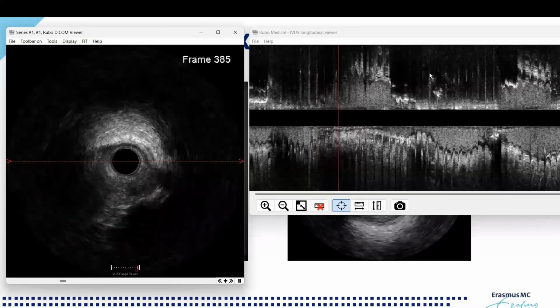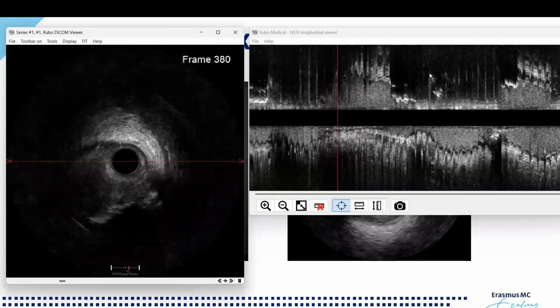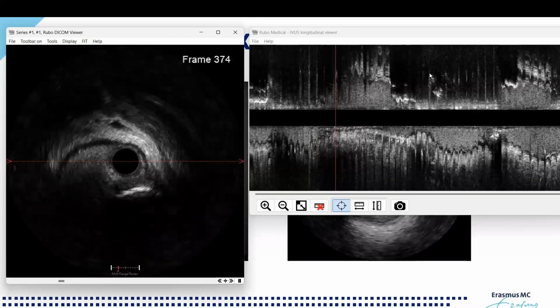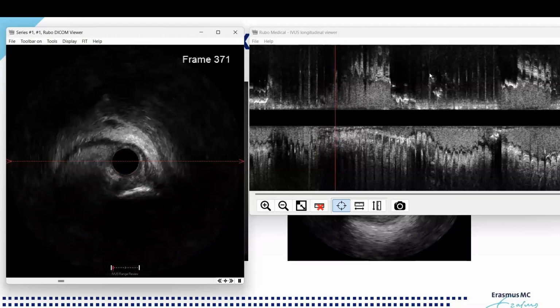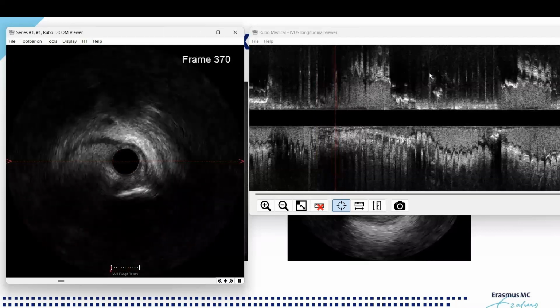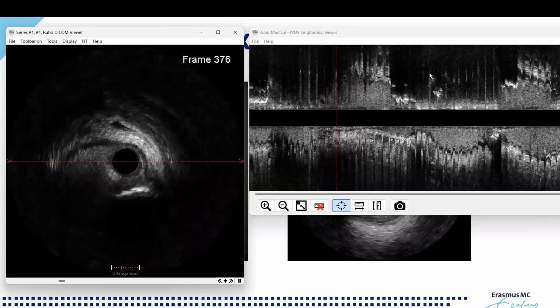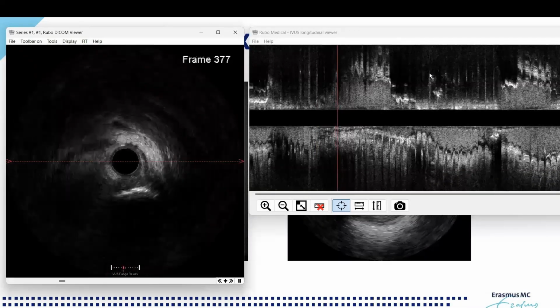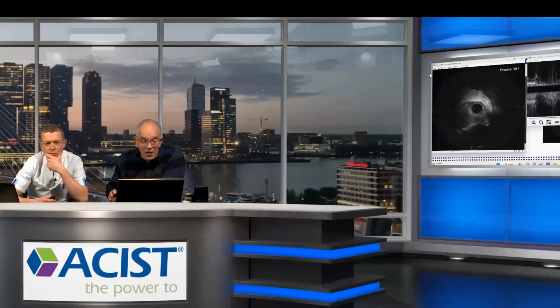It's true, but also here we have a little bit. It's difficult to see, because the guide wire is a bit hampering us in here. And we have also, and that is also one thing, you see, we start from one thing in the other, that also here I suspect that there is a tiny air bubble in the catheter, and that makes it so that please take your time to prepare your catheters before you put them in. That's because it hampers a bit your imaging.